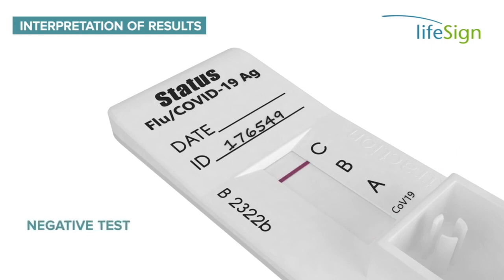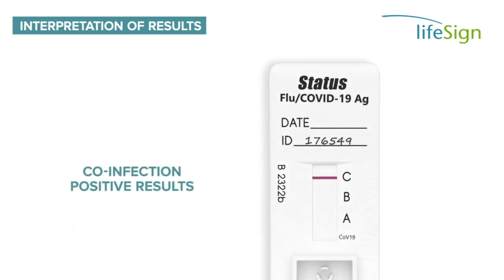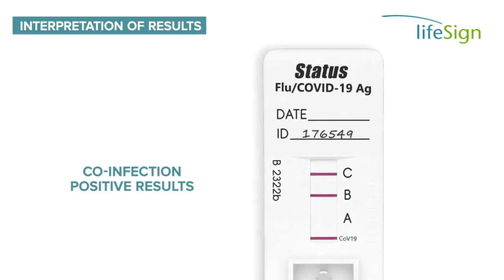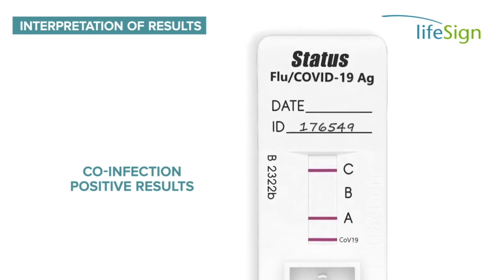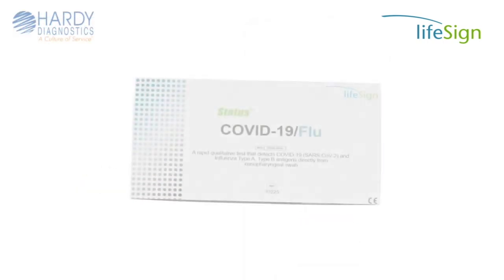A negative test will have no line at the B, A, or COVID-19 position of the test device. The test line may vary in shade and intensity — even a faint line must be interpreted as a positive result. Co-infection with Flu A, B, and COVID-19 is rare. Multiple positive result lines should be retested, and repeatable multiple positive test results should be confirmed by molecular assay.